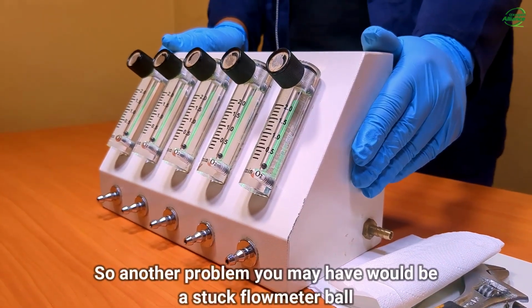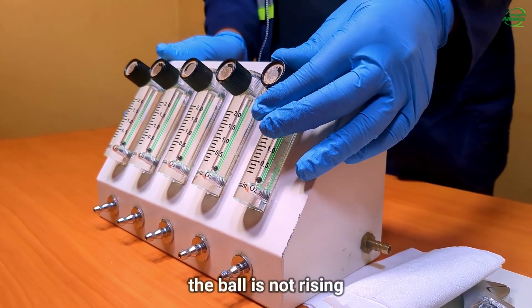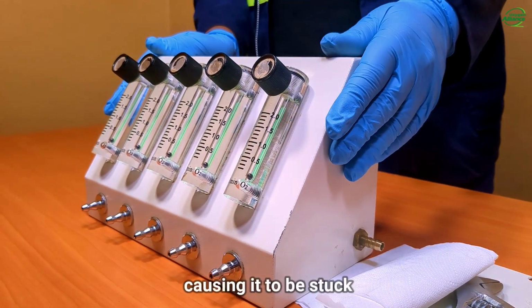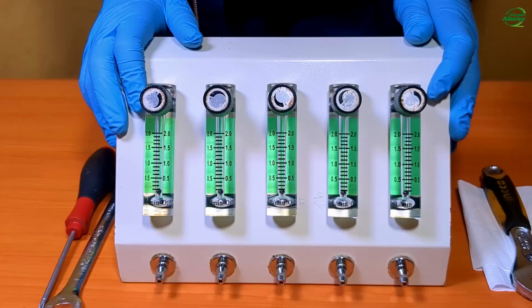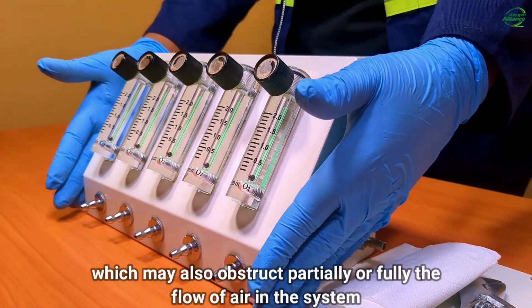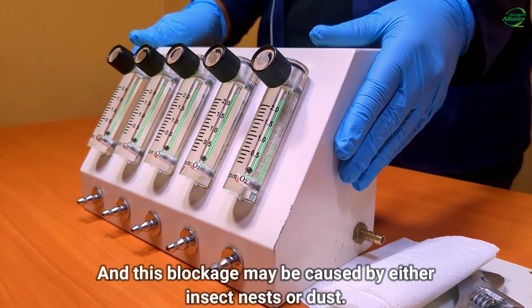So another problem you may have would be a stuck flow meter ball. It could happen that as you're adjusting your flow rate, the ball is not rising, and this could be caused by either water or dust that may have accumulated at the base of the ball, causing it to be stuck. And to deal with that problem, you have to clean your flow meter. And lastly, the other problem you may have is a blockage, which may also obstruct partially or fully the flow of air in the system. And this blockage may be caused by either insect nests or dust.